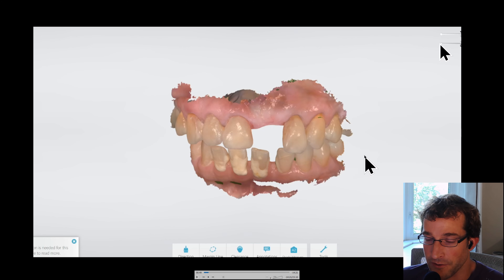There's some calculus on the lower anteriors that should be scaled off at some point. But here's the prep, and here's the grayscale. We'll basically send it to the lab and say that we want the margins to go somewhere around here on both of the teeth. So lots of surface area for bonding, relatively long space for a Maryland, but I think this one's going to do well especially with the bite.